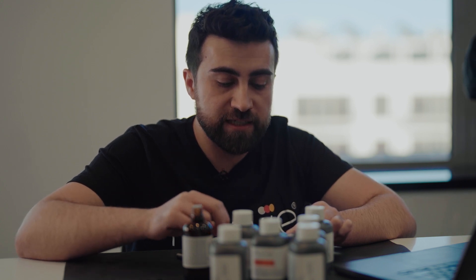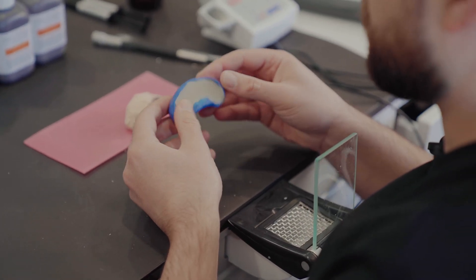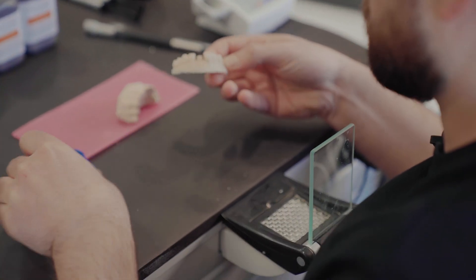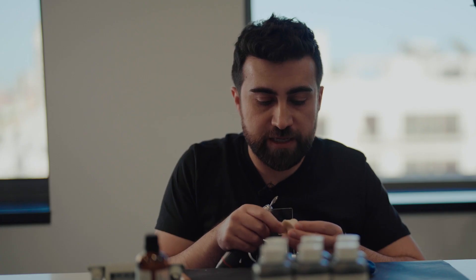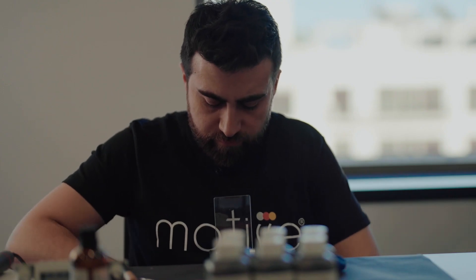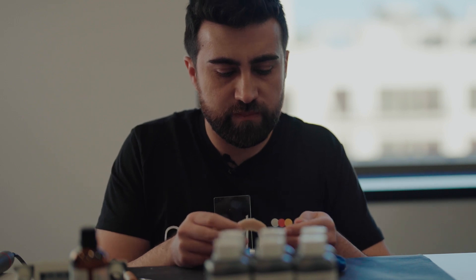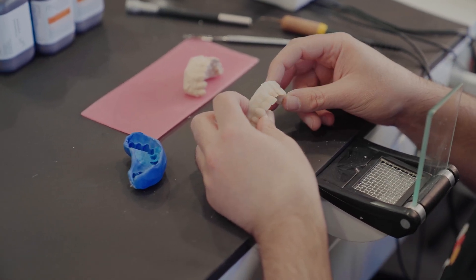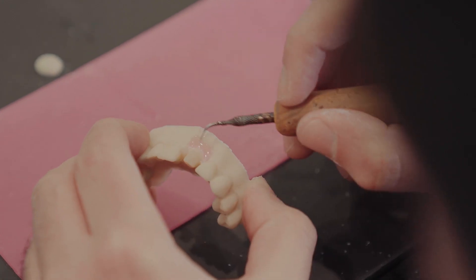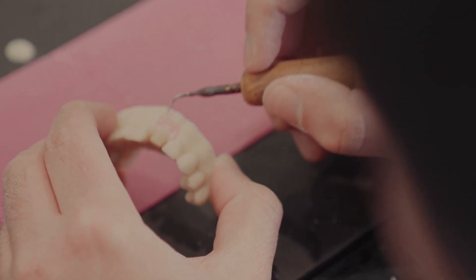Now we let it set, and then continue with the next step: removing the gum and replacing it with denture wax to replicate the gum color. The model is already cured, so I remove it from the silicone index. This is our beautiful model. I will now remove the gum and replace it with denture wax.